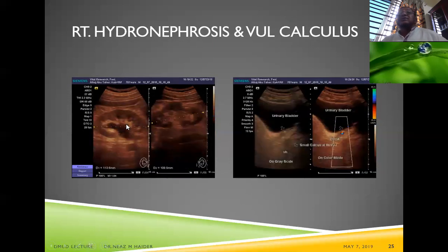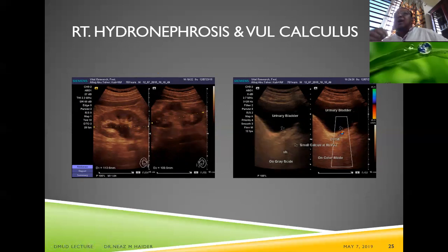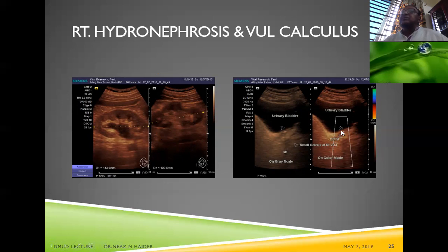When mild hydronephrosis is found in the right kidney with a small calculus in the right ureter, we should carefully look at the ipsilateral vesicoureteric junction. This is the VUJ calculus — when renal sinus splaying or mild hydronephrosis is detected, the corresponding VUJ should be carefully examined.